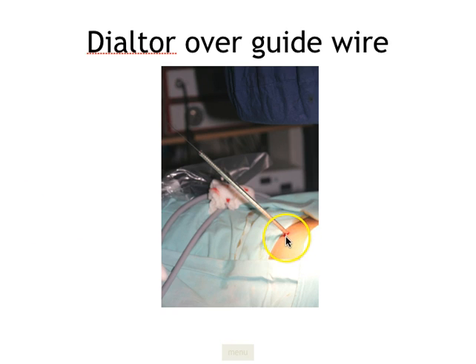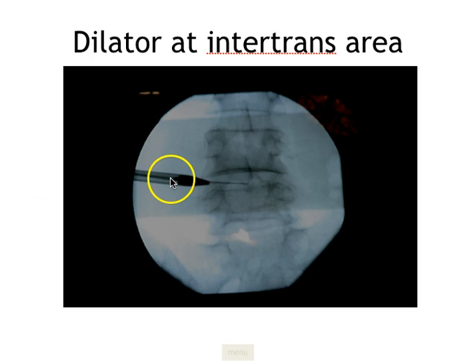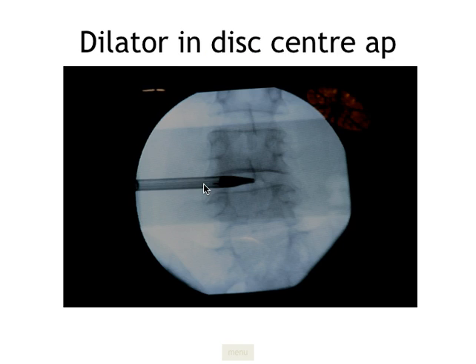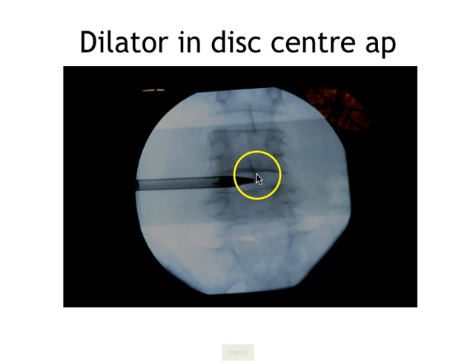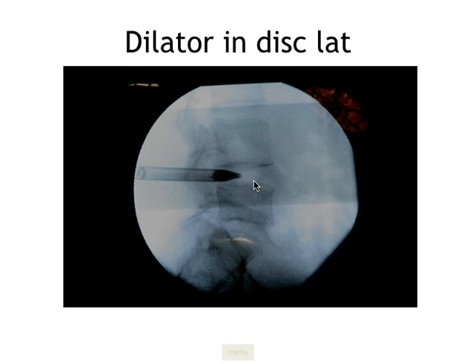We make a skin incision and introduce the dilator over the guide wire using its central hole. This dilator is a blunt instrument with two holes. We push it right up to the intertransverse area; the black tip of the dilator is 15 millimeters in length. We then tap the dilator right up to the center of the disc so the tip enters the disc — the 15 millimeters of the black portion is accommodated inside the disc. On the lateral view the dilator tip is confirmed to be in the posterior quadrant of the disc.